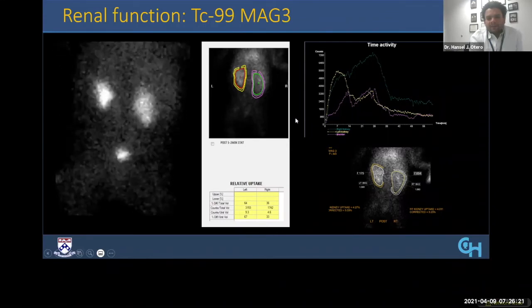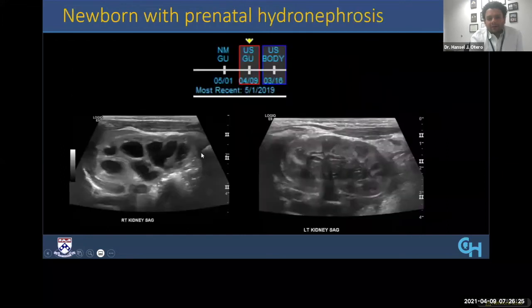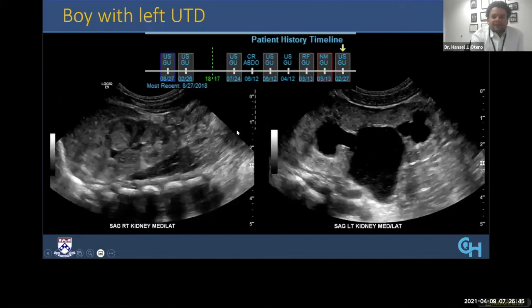where we see that the right kidney in this case, that again was the abnormal kidney, is accumulating radiotracer and only responds after Lasix. It gives us the differential function, telling us that the left kidney is doing most of the work, the right kidney is collaborating with 36%. This is a very important concept, so I'm going to start yet another patient, similar findings.